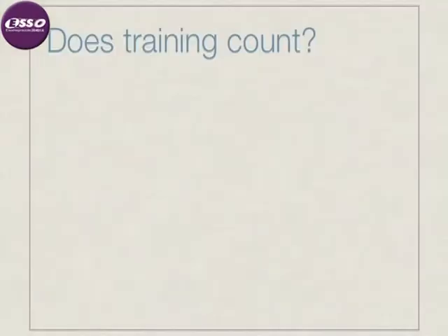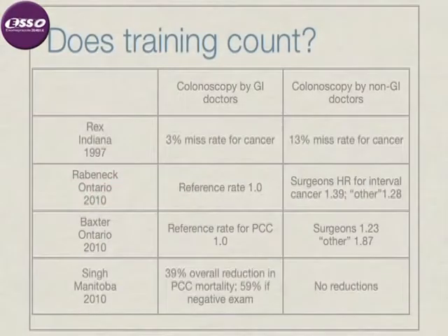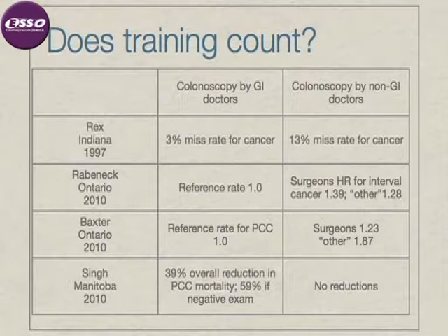A major deficiency of colonoscopy as a diagnostic, surveillance, and screening test is that the procedure is highly operator dependent. Several studies have shown that general surgeons and primary care physicians performing colonoscopy are more likely to fail to detect colorectal cancer than are gastroenterologists. This difference suggests, but does not prove, that training and detection is associated with better protection against colorectal cancer. The specific elements of training that lead to better detection have not yet been defined.